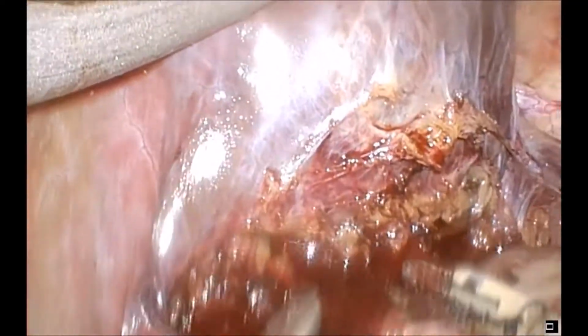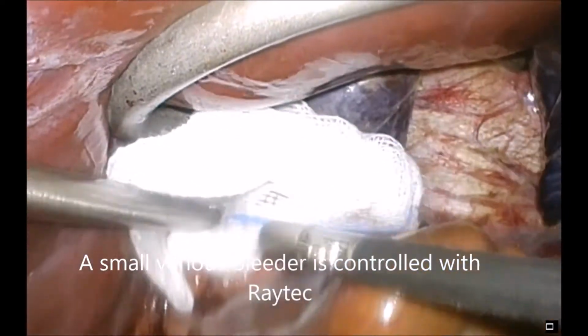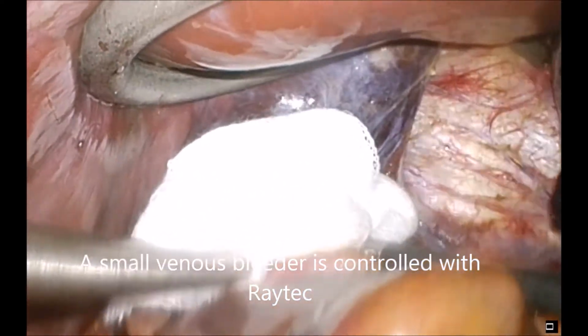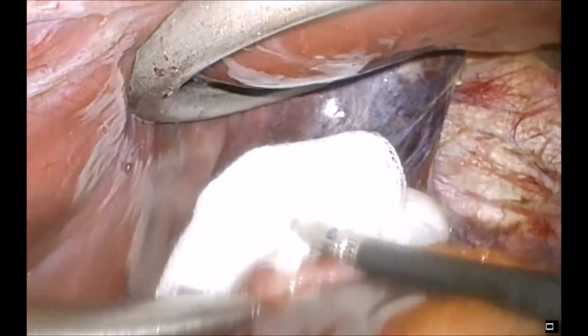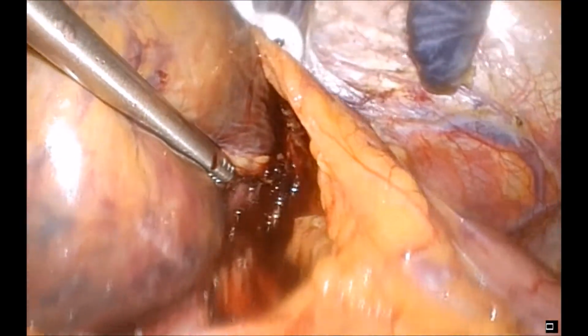Another small bleeder, this time a venous bleeder, occurs, and it seems safer just to pack that off and control it with a Raytec for a while and come back to it later on. That certainly controls the bleeding very straightforwardly.